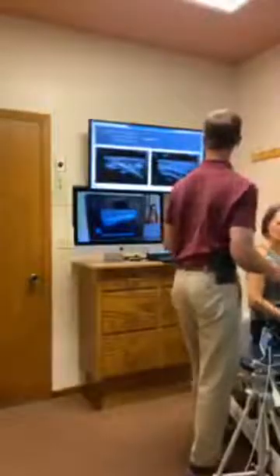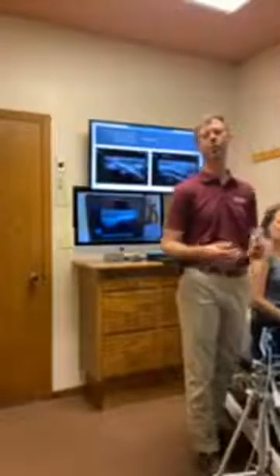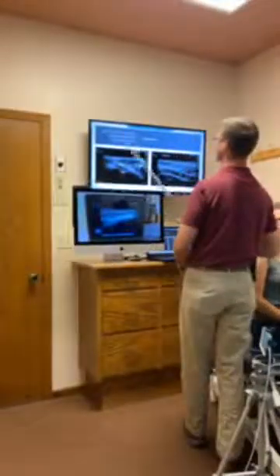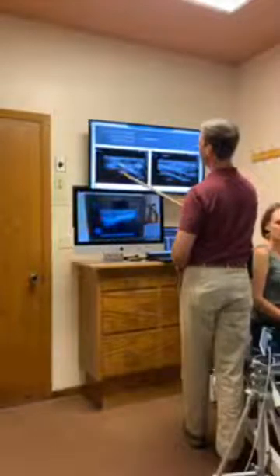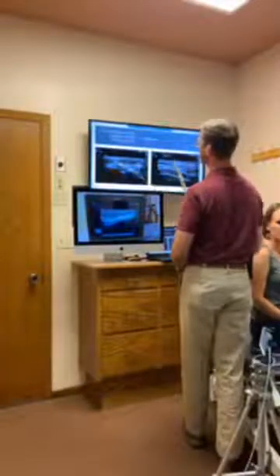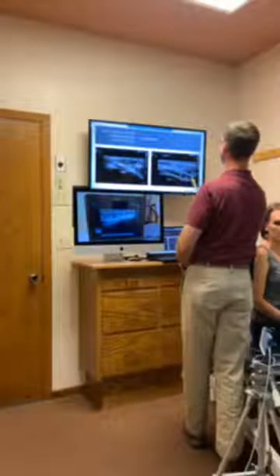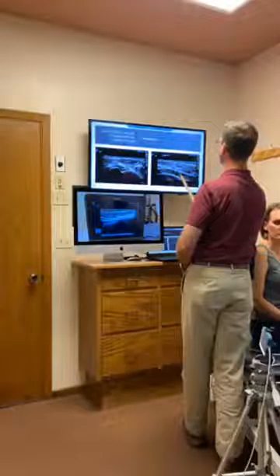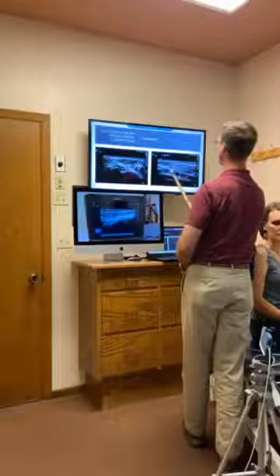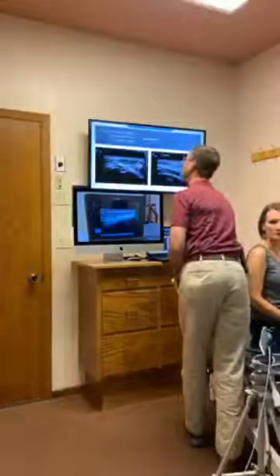Okay, so here we have a partial tear and effusion. And effusion is swelling of the structure. All right, so what we see here, again, here's the short axis view, that tendon. You can kind of see this part, but that other part of the circular structure is not very visible. And over here, there's loss of that fibrillar stringy pattern, and there's darkness in here, which is the swelling. And it's lost that same normal texture.